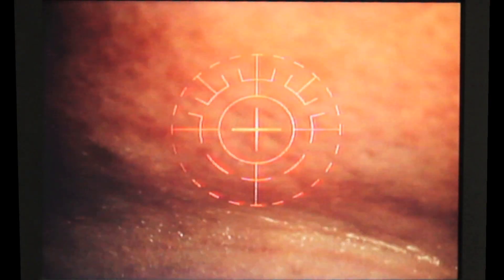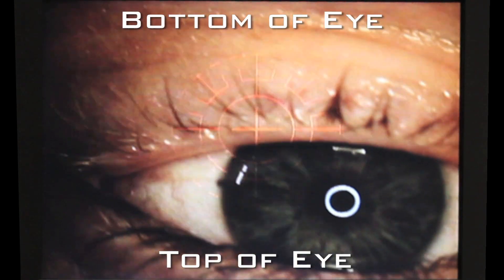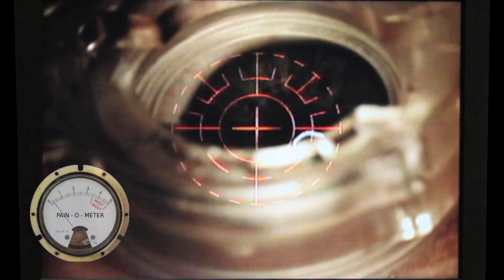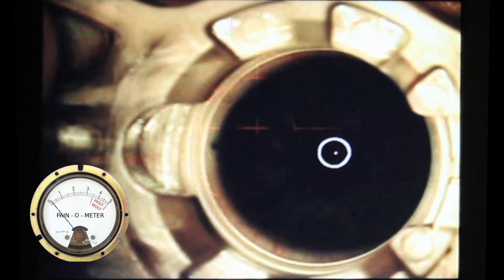All right, so I decided to give you the doctor's point of view. So this is my eye, upside down. The doctor is, I guess up to the doctor is towards my mouth. I guess my forehead is down below the screen. This is the worst part of the whole thing right here. They put the super clamp-o-matic eye opener 3000 on you here. And this is a little uncomfortable. That's the only bad part about it. I mean, the rest of the surgery is no big deal, but this is just so strange. You don't really know what to do.